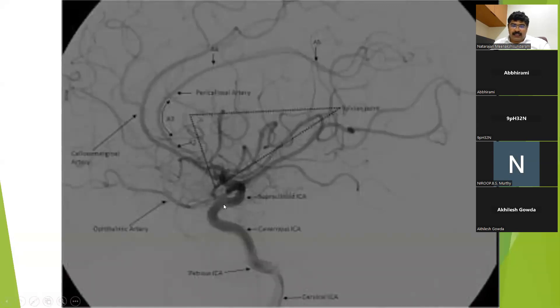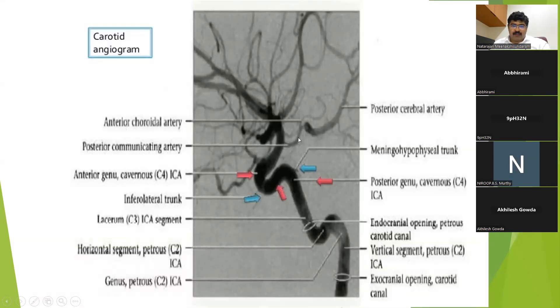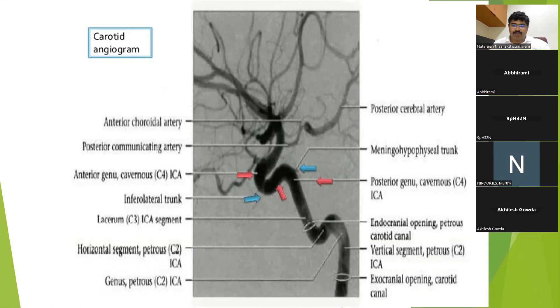This is the ICA, this is the ophthalmic artery, this is the callosomarginal artery which sits over the cingulate sulcus, and this is the pericallosal artery which sits over the corpus callosum. This is the prominent PCOM — the posterior communicating artery. The cavernous segment has an anterior genu and a posterior genu, and this part is called the carotid siphon.